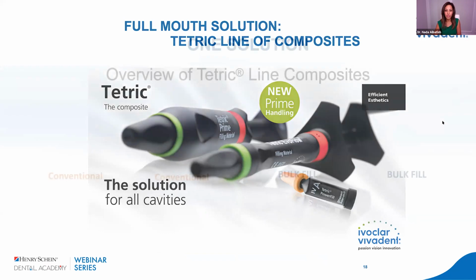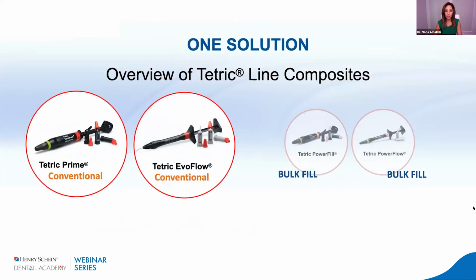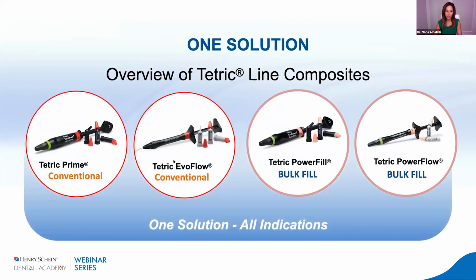So this is basically an overview of the Tetric line of composites. There are the conventional composites here. You'll see them on the left side of the screen, and then the bulk fill composites on the right side of the screen. Conventional means that it has to be placed in 2 millimeter increments. This is the stuff we learned about in school. 2 millimeter increment, and you cure it.